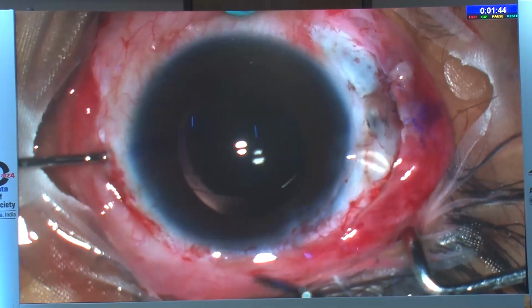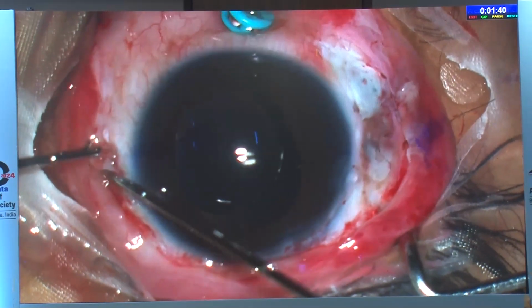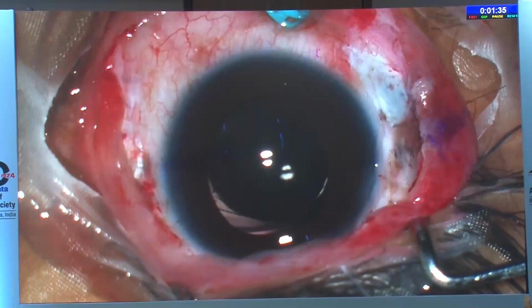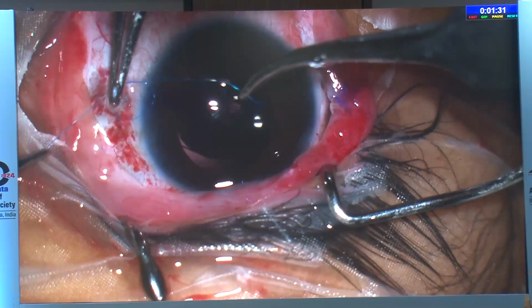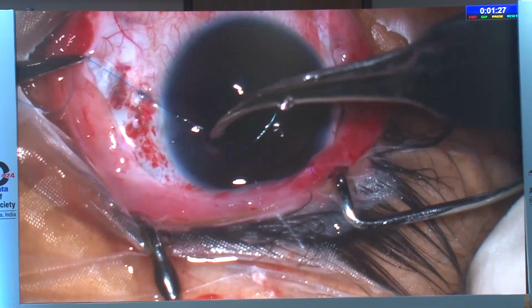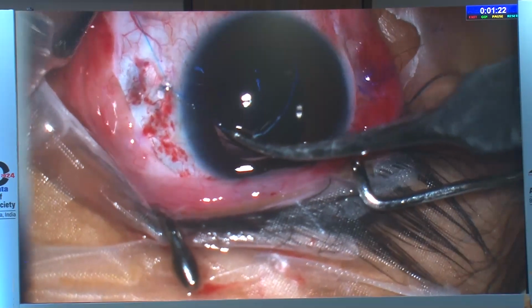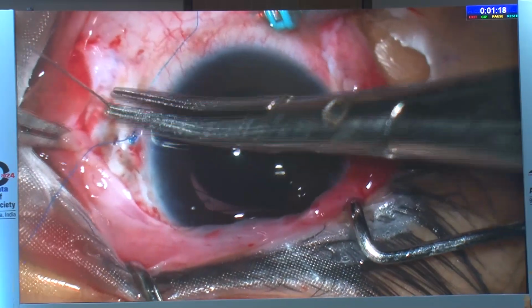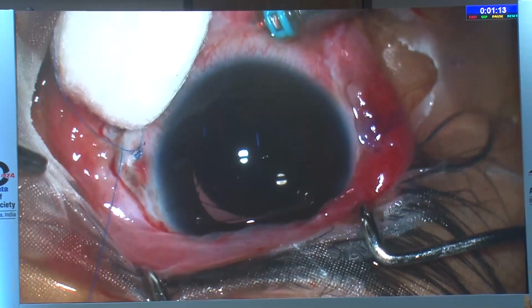So this guy had a scarred sclera, as you can see on the other side also. I initially thought I will explant it, but then I just brought it out. Then at the neck, I took a 9-0 Prolene suture tie and anchored it. So I just wanted to share these two complications which I have had and how we managed them. Afterwards, I made another scleral flap to cover this.